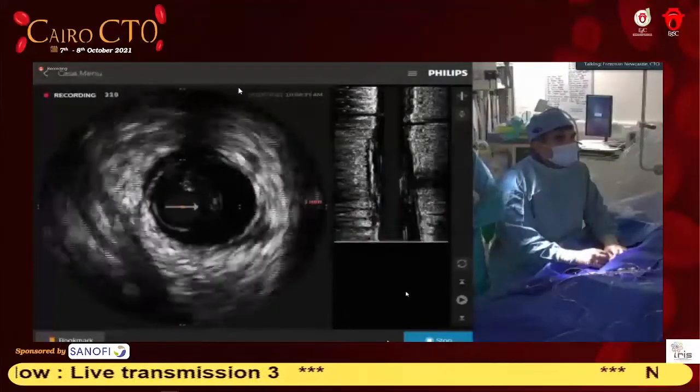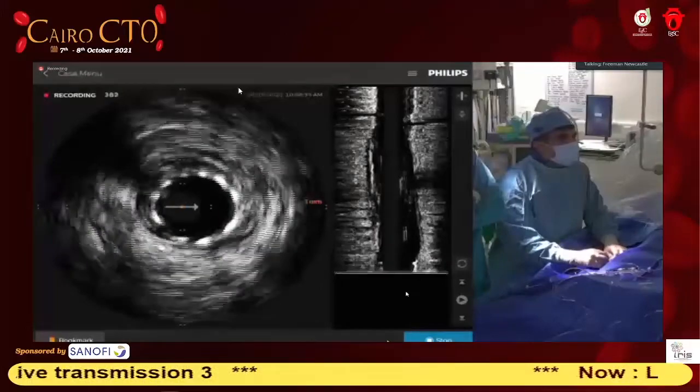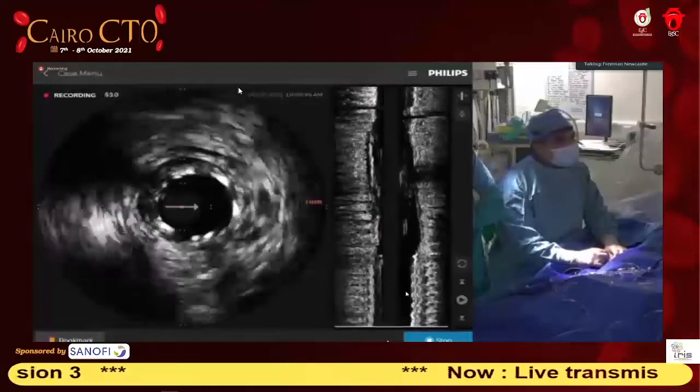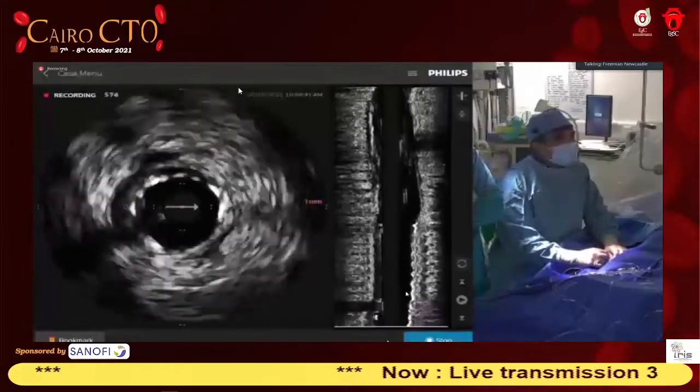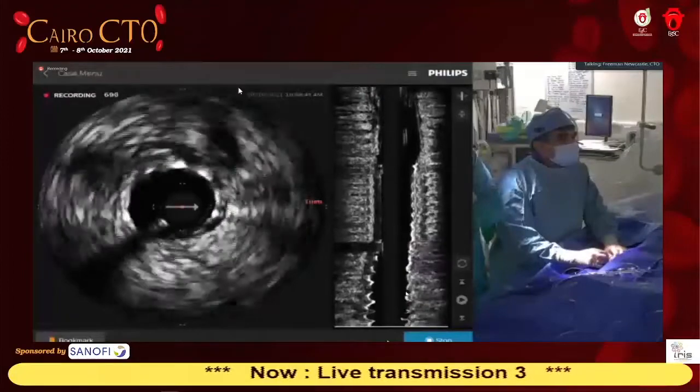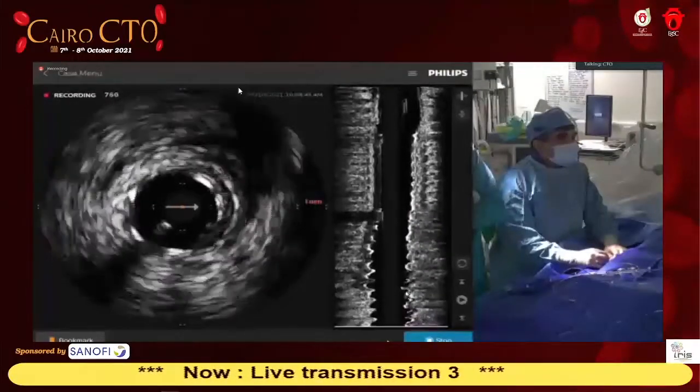So yeah, can you see it from Agate? Yeah, so I think what we could do, see the 3.0? I mean, that's expected, but I would rather post-dilate it now and not worry too much, because I know, and here's the 4.0. So, yeah, 3. I thought that you would put 3.5.